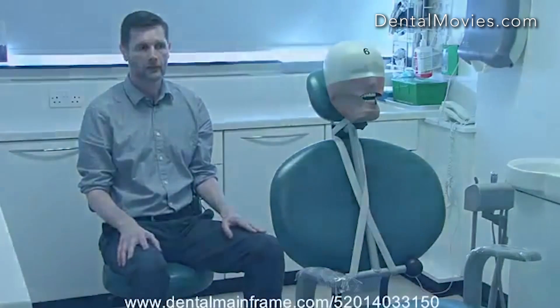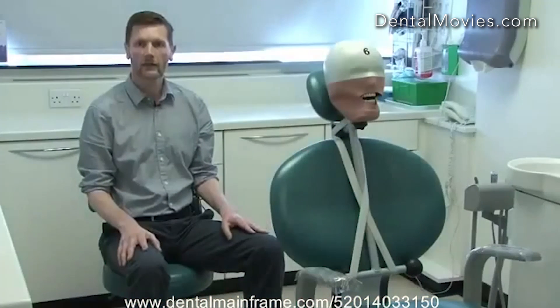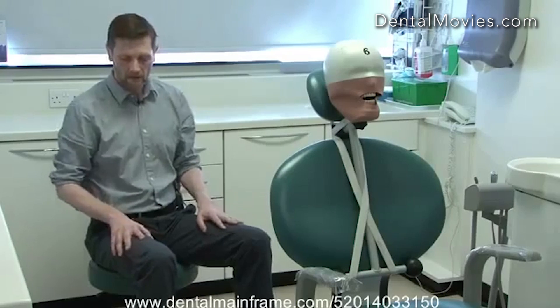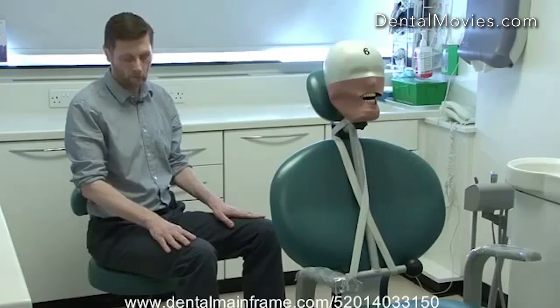I'm going to look at three things separately. The first thing is how we adjust the dentist chair. When we want to sit back in the dentist chair, we should be sitting so that the undersurface of our thighs is parallel with the floor and the top surface of our thighs will be slightly pointing downwards.